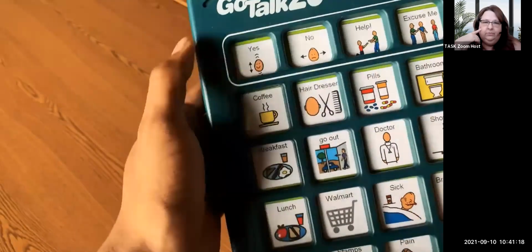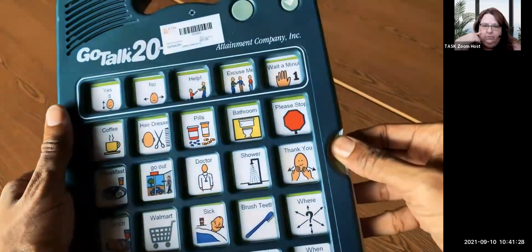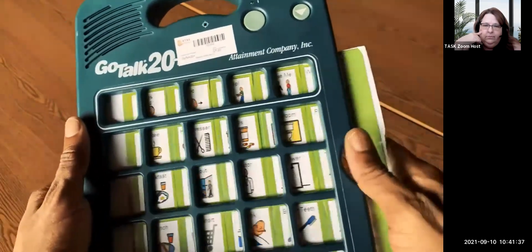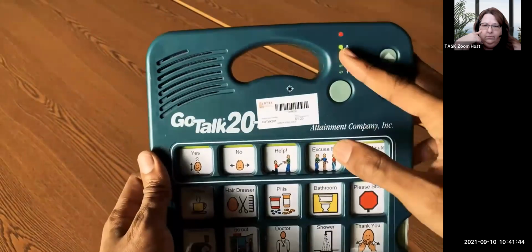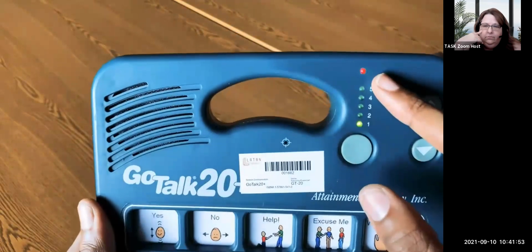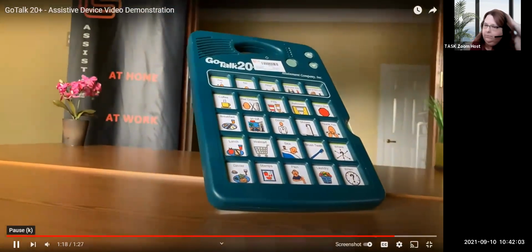To activate one of the pre-recorded messages, simply press on one of the large message squares on the keyguard. Lunch. The overlays are stored inside and slide in and out very easily. Pictures for overlays can be printed from offline, or words can simply be written on a piece of paper and slid inside. To record a new message, simply press the record button on the back of the device. A red light will shine on the front, telling you that it's in record mode. Switch to your level, then press on the speech blurb that you want to record on. Once it's pressed, the red light will begin flashing, letting you know that it's recording. Simply press the record button on the back again to finish the recording. The GoTalk is a great communication device for people who have limited speech, people who have had strokes, have autism, and many more.